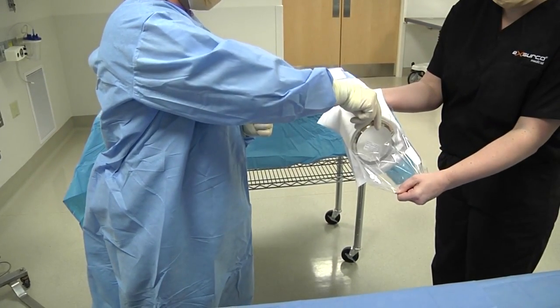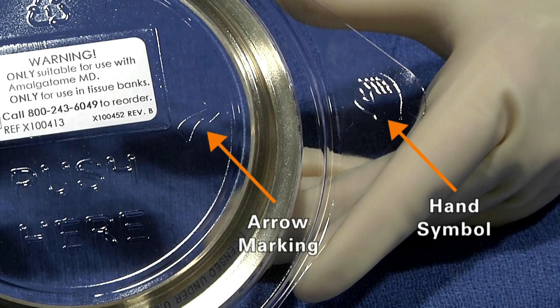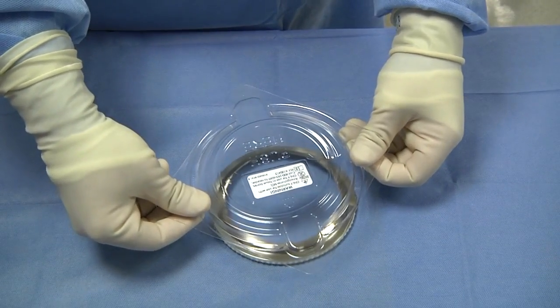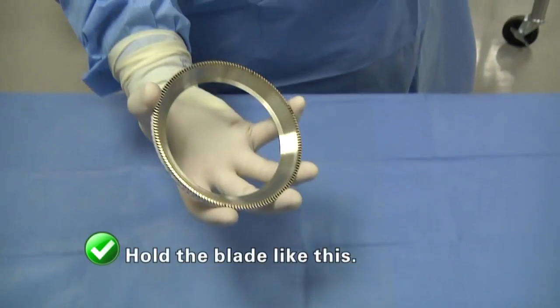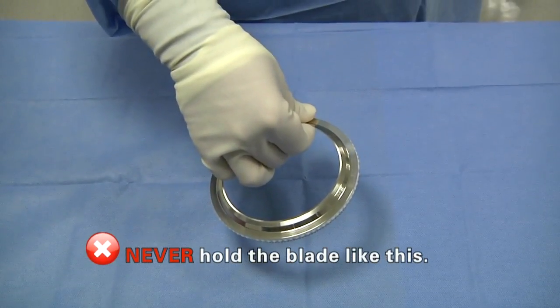It is best practice to have the package opened for the sterile operator. To remove the blade, hold the plastic tray where the hand symbols are and gently press your thumbs at the arrow markings. When handling the blade, it is best practice to always hold it on the outside edge. Never hold the blade like this.